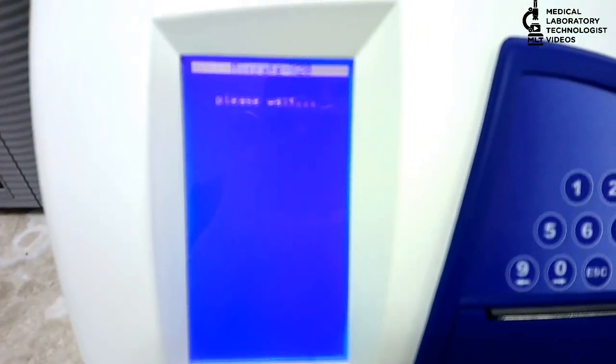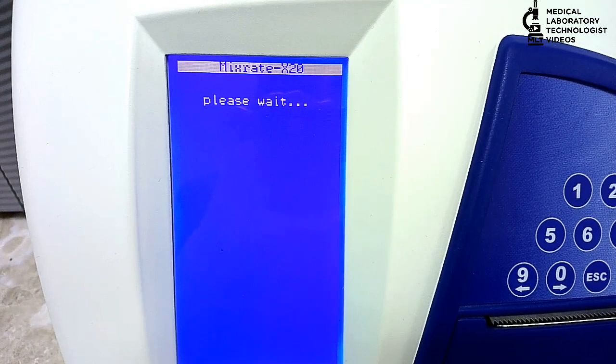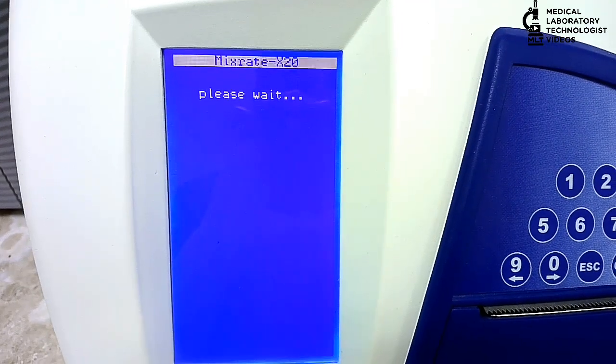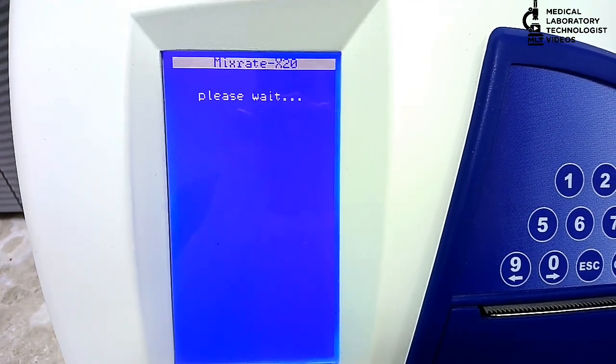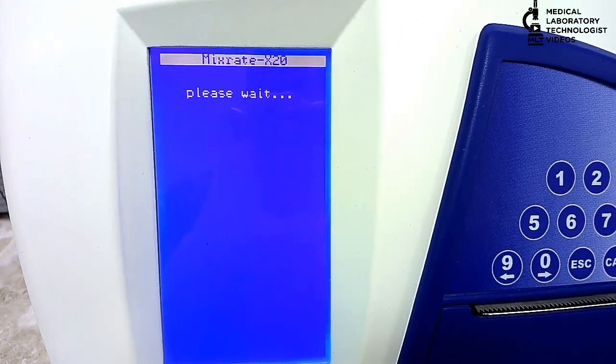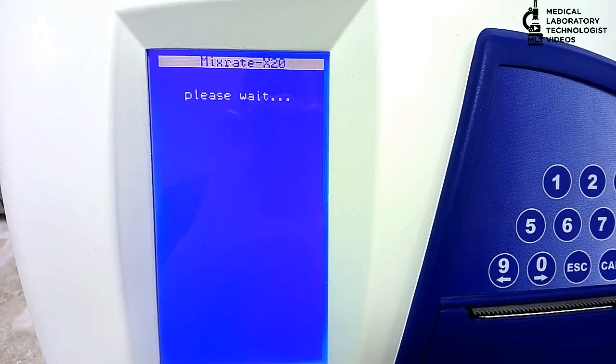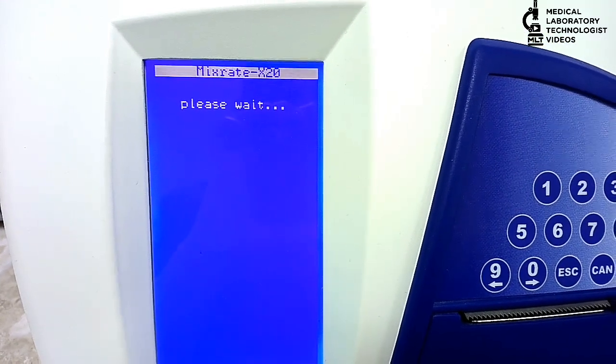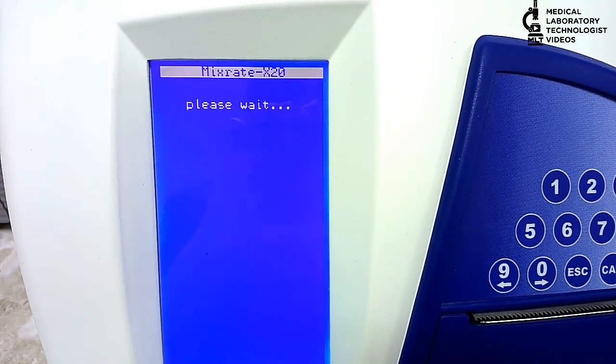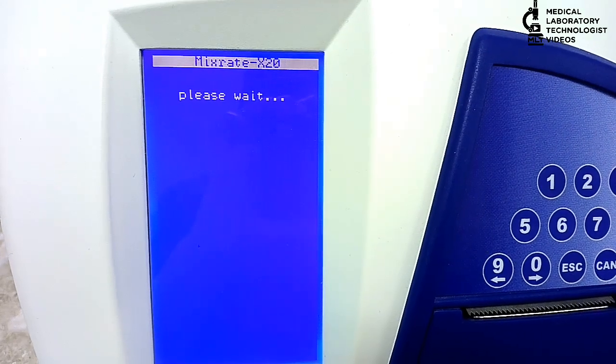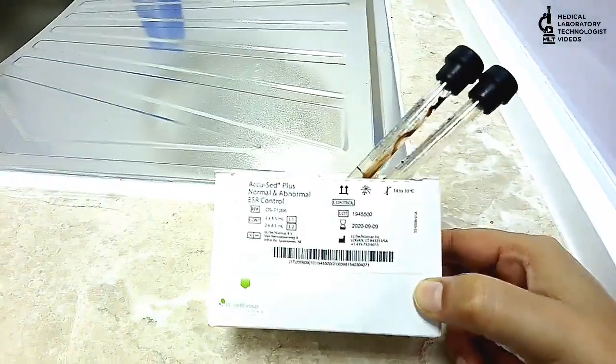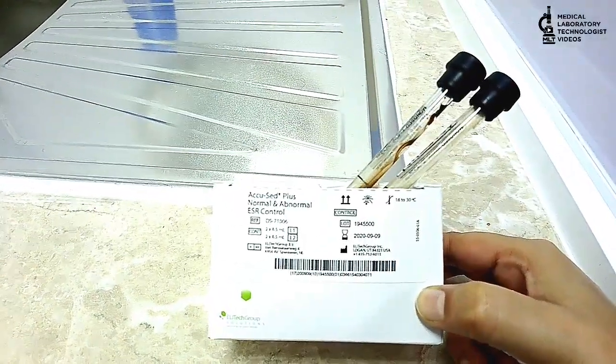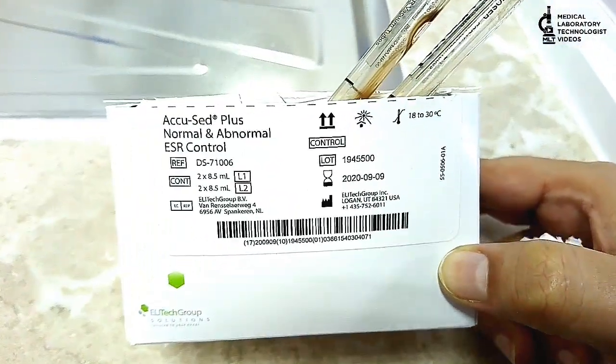Then it will show 'Please wait,' it will take some time until the main screen appears. Until that, I will show you the controls of this machine - normal and abnormal controls that are available with the same company.